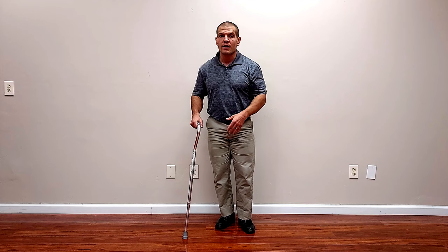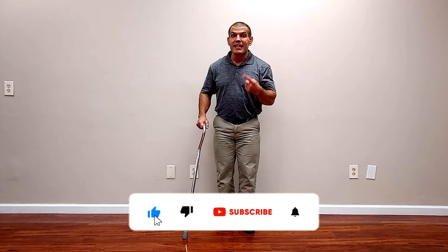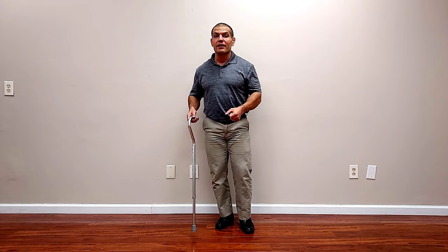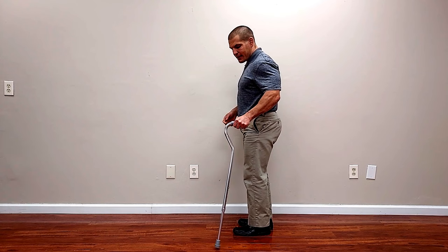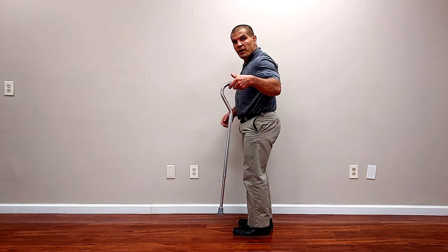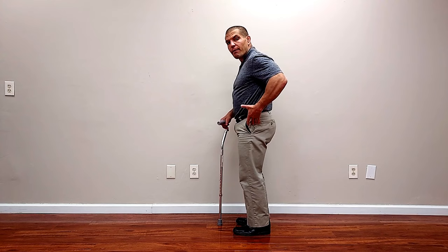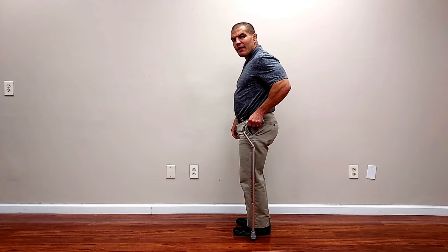The number one step is getting your cane adjusted correctly. A cane that's either too low or too high is not going to help you walk ideally. When you are using a cane, you want your elbow to be bent about 20 to 30 degrees when the cane is six inches in front of you and six inches out to the side. Another quick rule of thumb: for most people, it's around the height of your greater trochanter, or the bump on the outside of your hip.